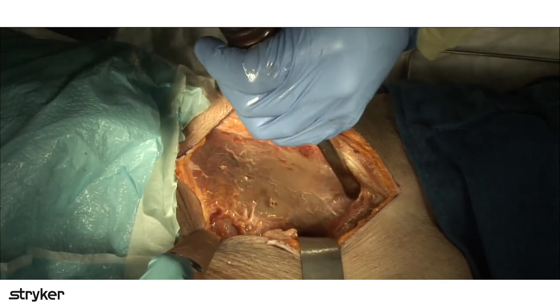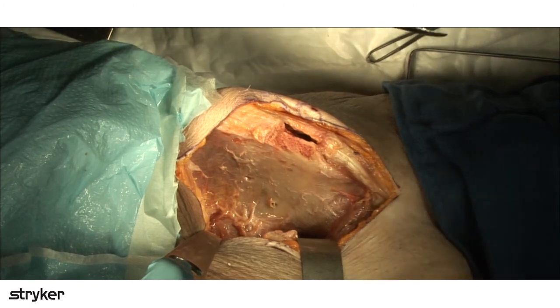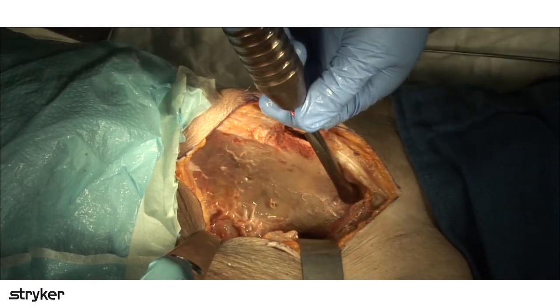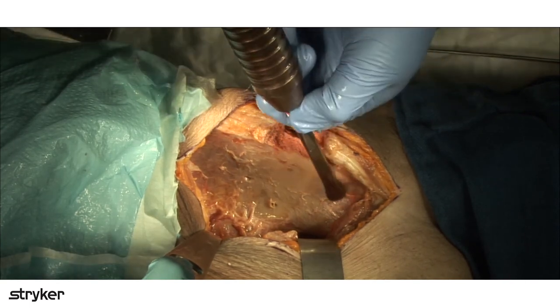You can get at those anterior wall fragments from below as well by incrementally releasing the rectus and rolling it out. But the bigger or fatter the patients are, you may be limited in how lateral you can get through the AIP, and this ASIS osteotomy will get you there from the other direction.